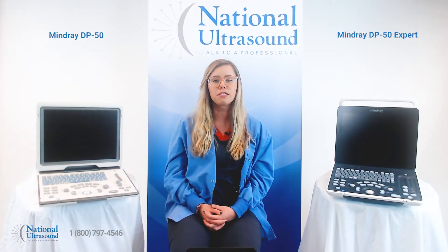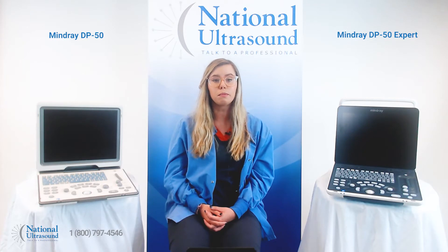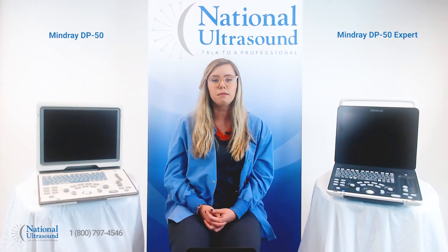My name is Cara and I'm a registered cardiac sonographer with four years of experience. Today I'm at National Ultrasound comparing the popular Mindray DP50 with the brand new Mindray DP50 Expert. The DP50 Expert is a new upgraded model, and it is the perfect solution for the practice looking to perform consistent OB/GYN, vascular, musculoskeletal, small parts, and general imaging exams.